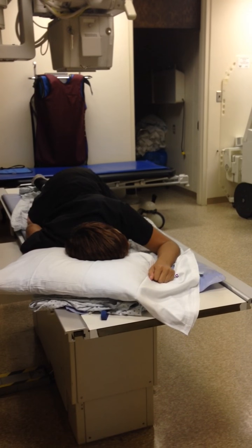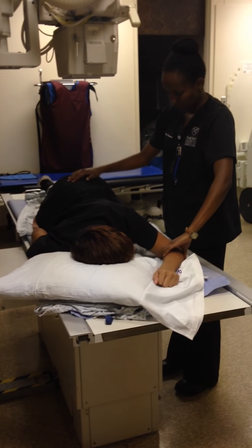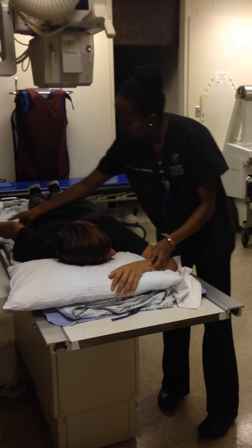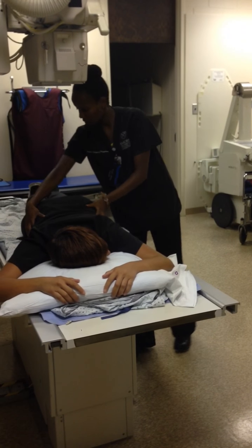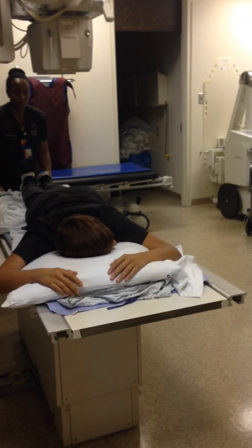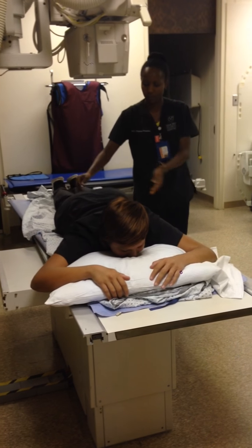Eat, breathe. The next projection is a PA projection of the stomach. This projection is utilized to see the mucosal lining of the body and the pylorus of the stomach with contrast and air. The patient will lay prone on the table, shoulders abducted to 90 degrees above their head. Make sure that the pelvis and hips are in the same plane and that the patient is not rotated.